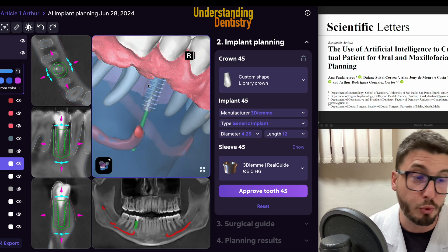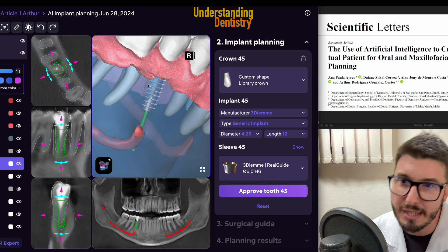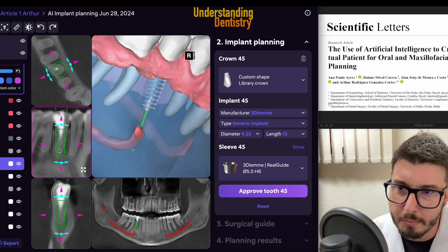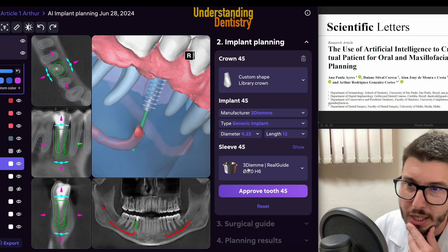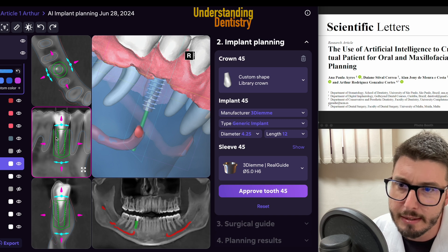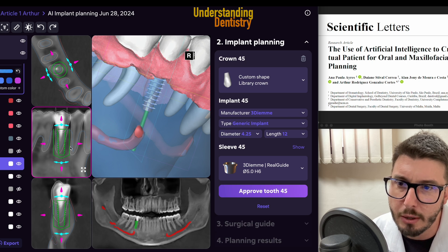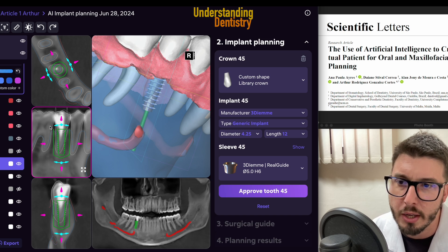Of course the root is still here, so let's imagine this root is fractured — I am planning an immediate implant. I have the implant planned here. I can select the libraries. We are not going to cover all the details because there is another video on image-guided surgery and implant planning with CBCT. Basically, these are the safety margins — this outer green contour is the safety area, but the area occupied by the implant is only the inner fixture contour.